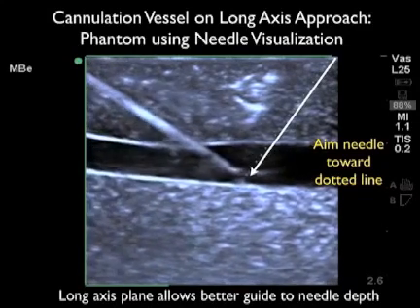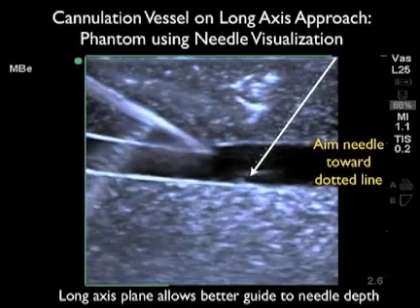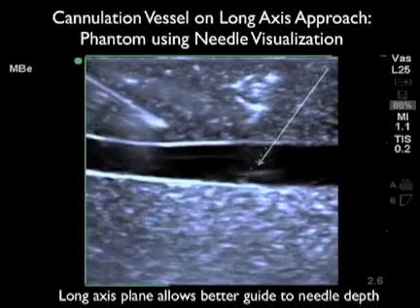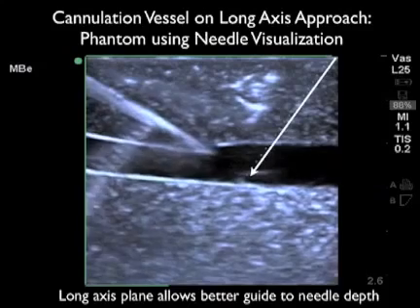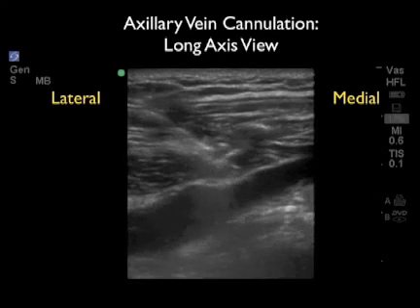Thus the long axis plane allows a much better guide to needle depth and allows you to gauge where the tip of the needle is at all times. Thus I generally start with a short axis approach and then flip to long axis. In this video clip, we'll look at a real-time axillary vein cannulation in a real patient.